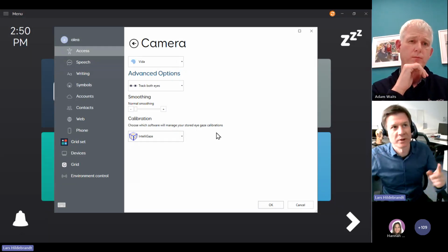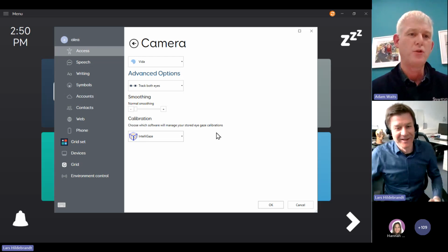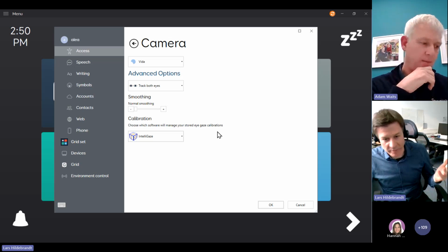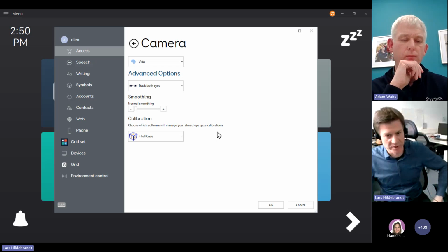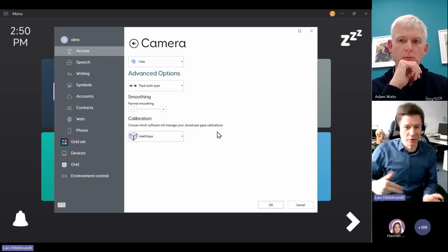We don't call it profile because we have used the wording profile for something else. Yeah, poor choice of words, sorry. We call it, we load and save calibration. Maybe a calibration profile, but you can have a calibration for glasses or one without glasses if the user switches between with and without glasses, or you can have a profile for outdoor and one for indoor.